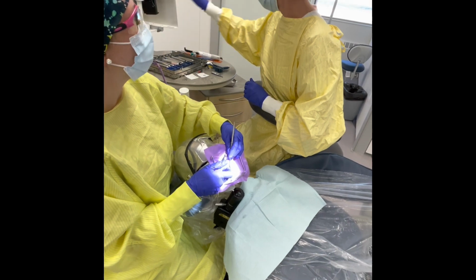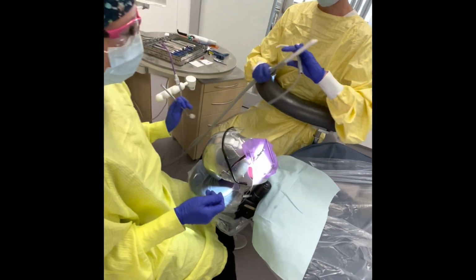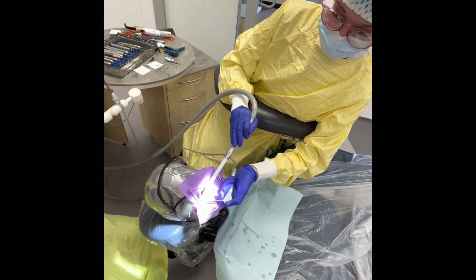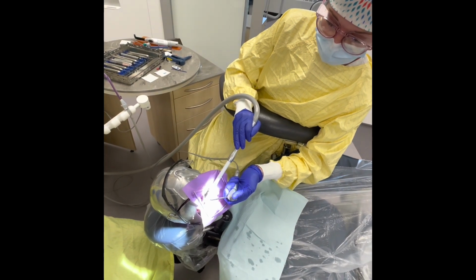So we are ready to begin our bonding sequence. Okay, I'm going to just wash that prep first. The purpose for washing and drying is making sure that we have any possible debris out of that preparation and then it's clean before we go ahead and proceed with our bond.